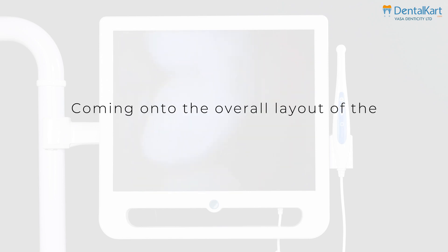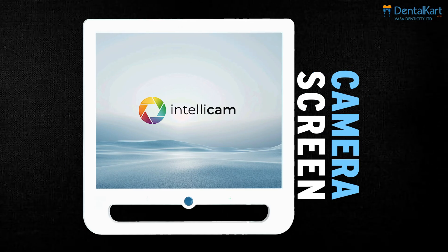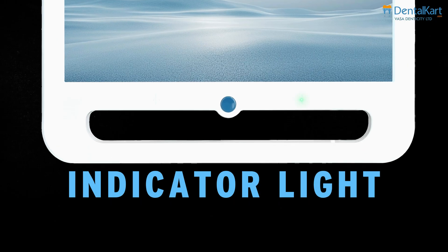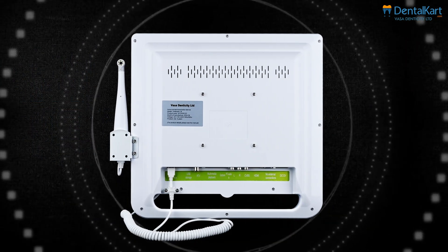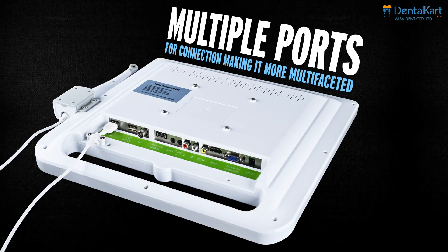Coming on to the overall layout of the IntelliCom 16 intraoral camera. On the camera screen, we have a power on/off button and an indicator light for remote control reception. Exploring the rear side of the screen, the speaker provides clear and immersive audio for an enhanced viewing experience, and there are multiple ports available for connection, making it more multifaceted.